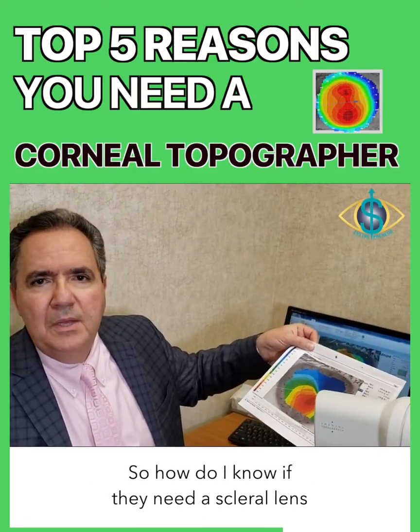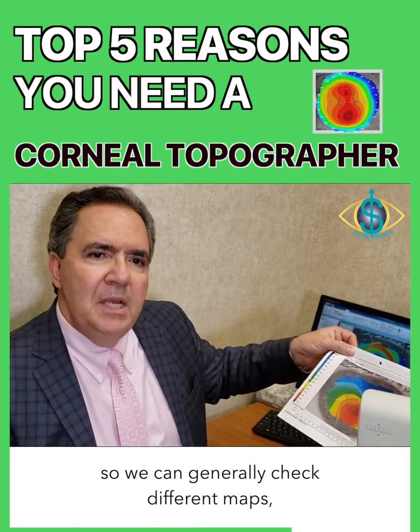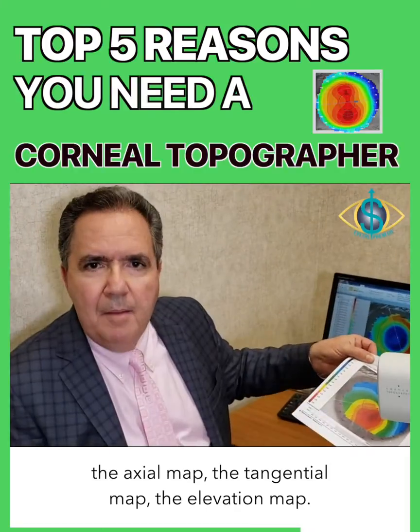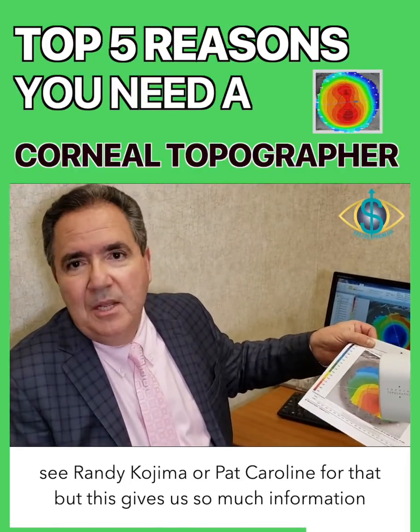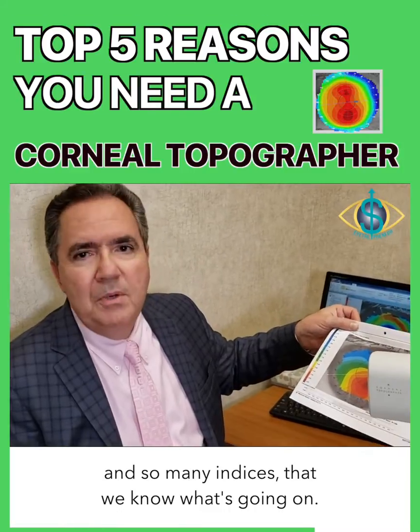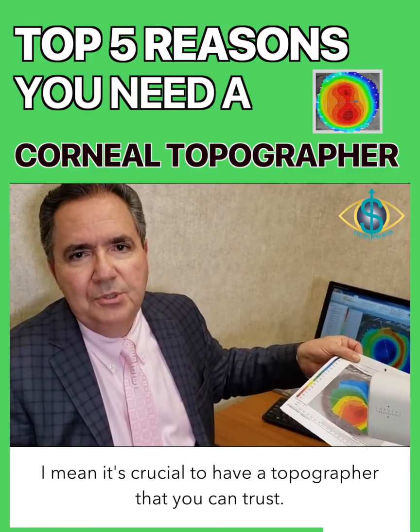So how do I know if they need a scleral lens or a regular one? Well, there's a formula for the elevation map. So we can generally check on different maps, the axial map, the tangential map, the elevation map, and this is not a course in topography. See Randy Kojima or Pat Caroline for that, but this gives us so much information and so many indices that we know what's going on. And for sclerals and for Ortho-K, it's crucial to have a topographer that you can trust.